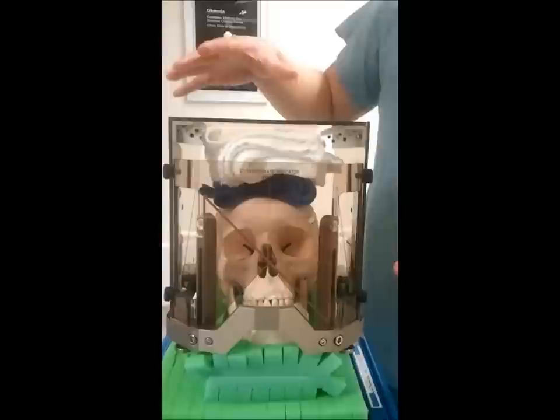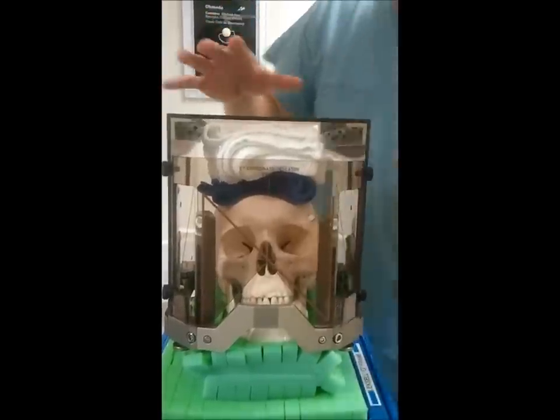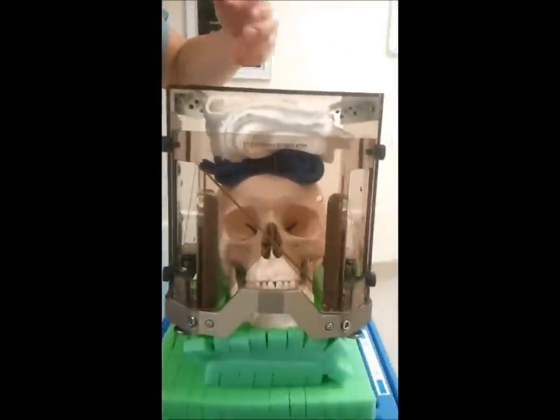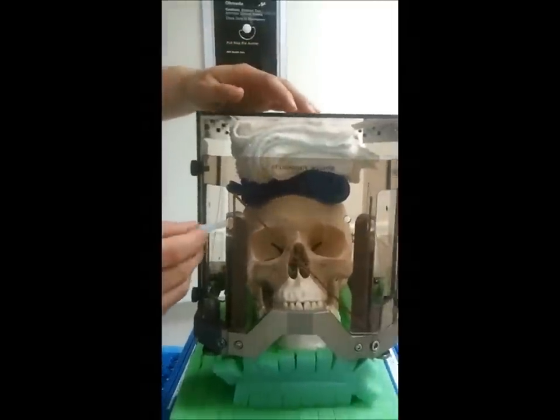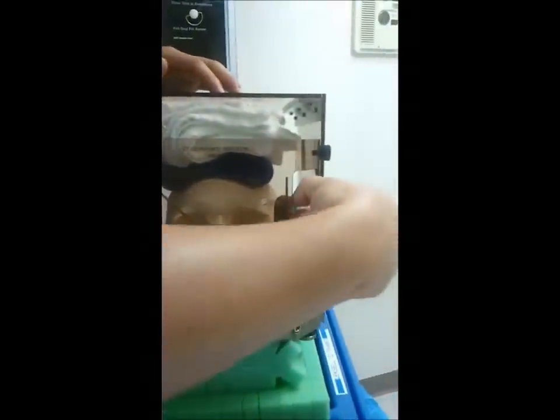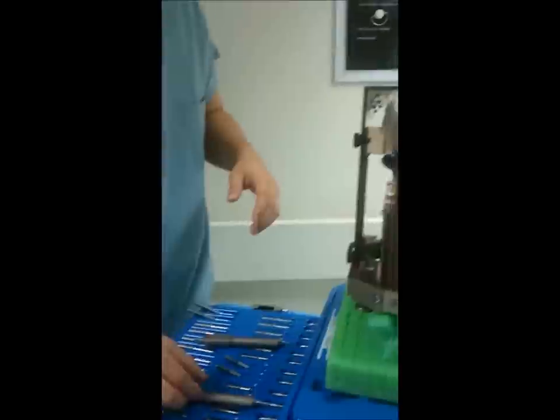I'll demonstrate that in a minute after we get this skull instrumented. I've already pre-measured some of the screw lengths by using a syringe, but you can also use a Q-tip or a sponge stick — it works just as well.